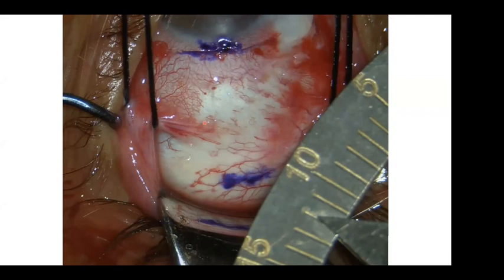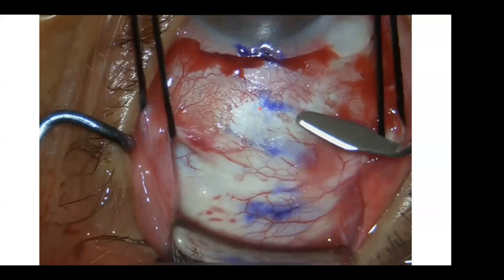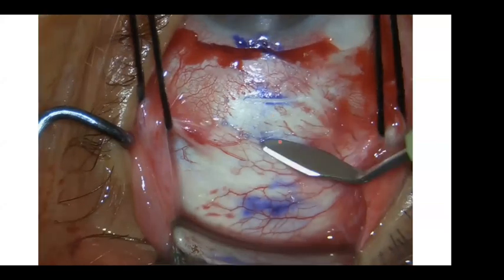Though it is technically difficult, I think the benefit of this procedure is quite good, and it has been an internationally accepted step. So I do an initial measurement of 12 millimeter, and then I divide this 12 millimeter into 3 millimeter parts: 3 millimeter, 3 millimeter, 3 millimeter, and 3 millimeter, 4 parts of 3 millimeters. And then I create scleral incisions using the crescent. The crescent is a very helpful dissector for the sclera, but just beware if the crescent is very sharp, because it can cut through the sclera, and as I'll show you next week, inshallah.